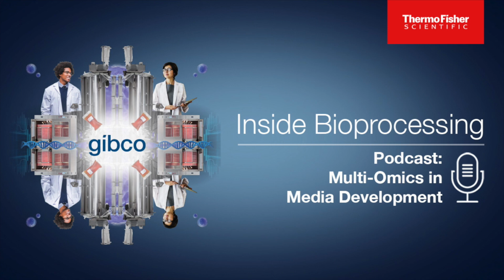You just know that it's running out. And you could add more in hopes, and that's what many people did for the longest time. They just added more cysteine. But sooner or later, you're going to get to a solubility limit where you can't add any more. And that's where you need to start asking questions like, well, why is the cell needing this much cysteine?